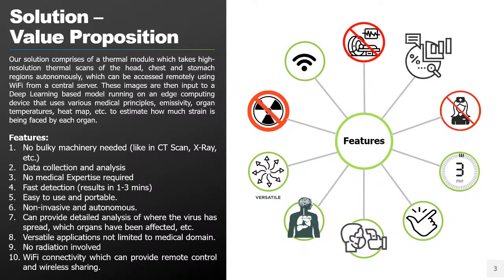You don't have to change the device, you just have to change the model, and that's it. You can directly use it even after the pandemic has subsided or settled. And as I said, it is remotely controlled, so Wi-Fi connectivity can provide remote control.